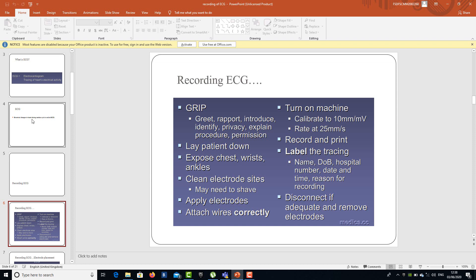Then we apply the electrodes, attach the ECG wires correctly, and turn the machine on. The calibration is set to 10 millimeters per millivolt and the paper speed is 25 millimeters per second. We then record, print, and label the tracing with the patient's name, date of birth, hospital number, date, time, and reason for recording. After confirming the tracing is adequate, we disconnect the machine, remove the electrodes, redress the person, and ask if they are comfortable before asking them to leave.